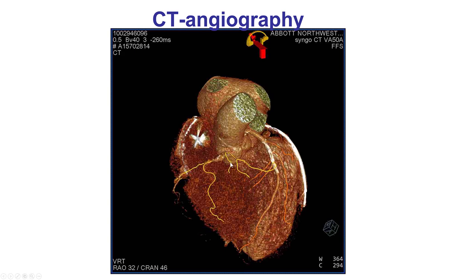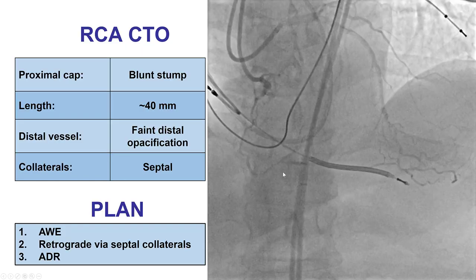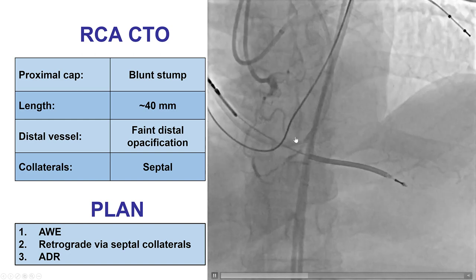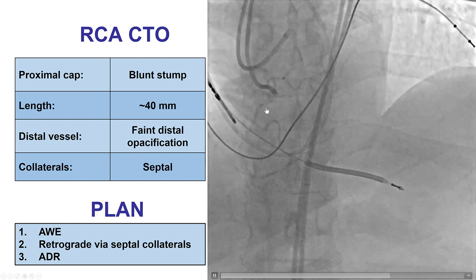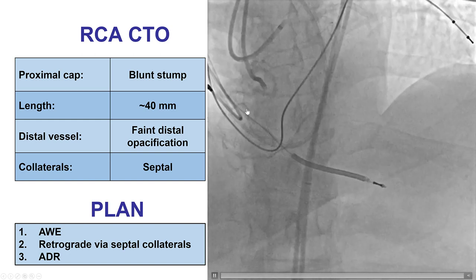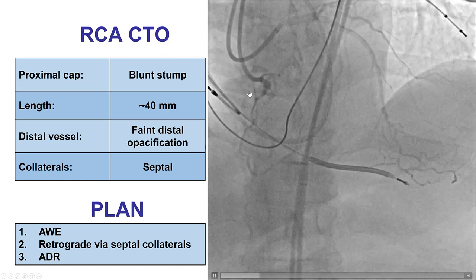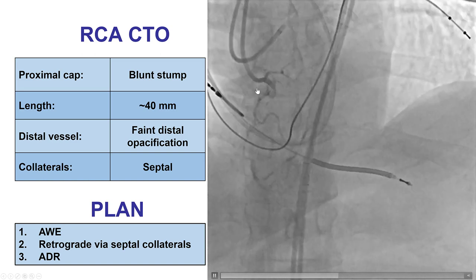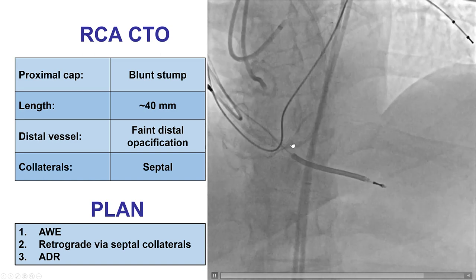A CTA was done before the procedure. There is an occlusion of the proximal right coronary artery. Right at the proximal CAP, there is an acute marginal branch. There is also a patent LAD with previously placed stents. On dual injection, there is ambiguity in the proximal CAP due to the take-off of this large acute marginal branch.